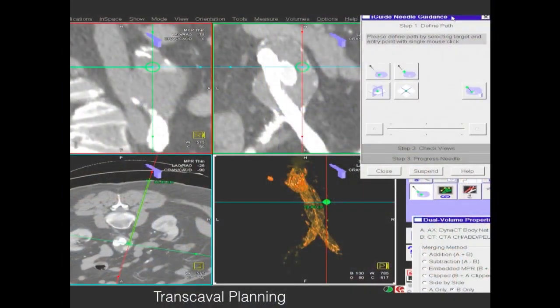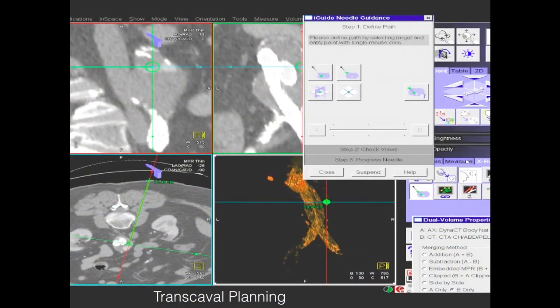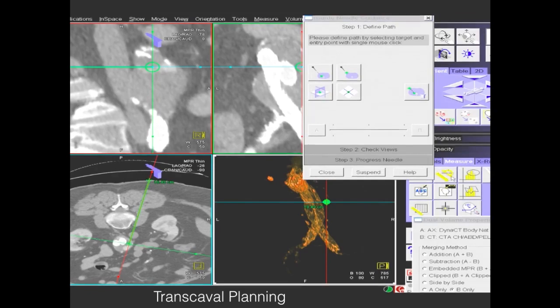Here's another example where we're actually using transcaval access to an anteriorly placed endoleak. That also helps you avoid the stent graft itself.